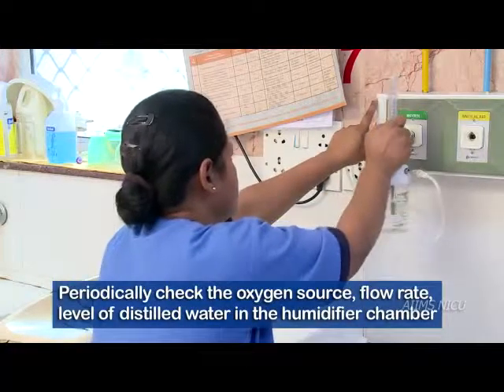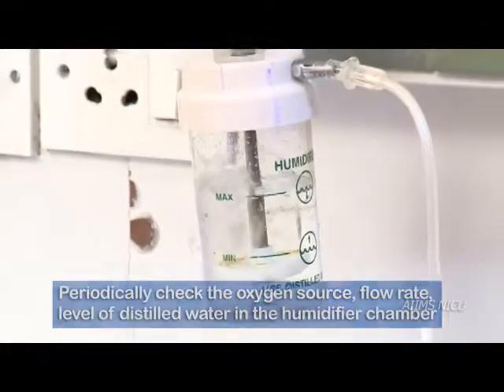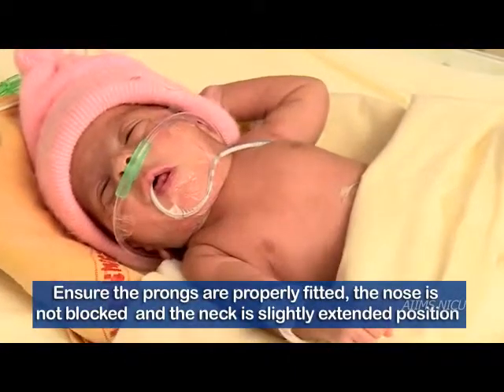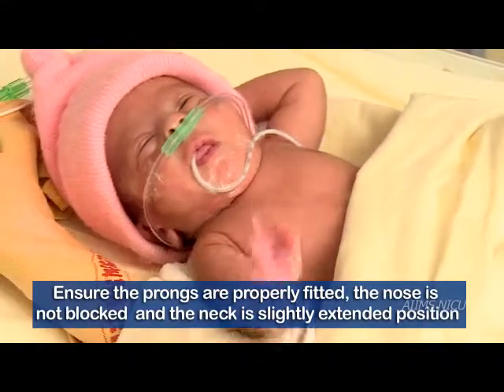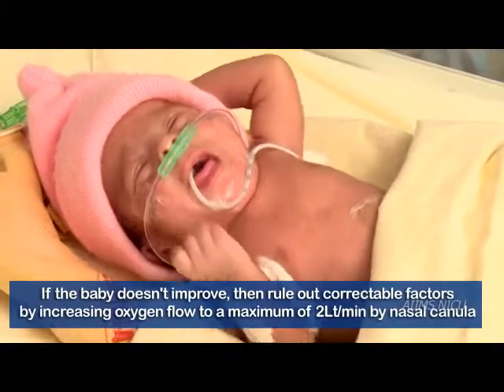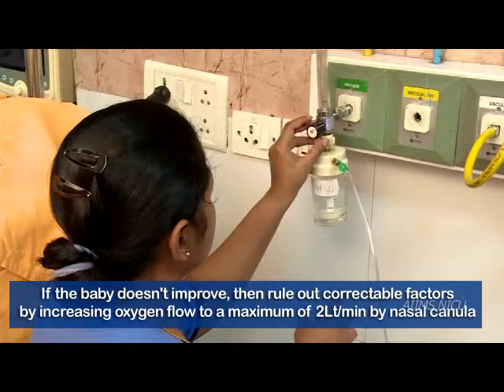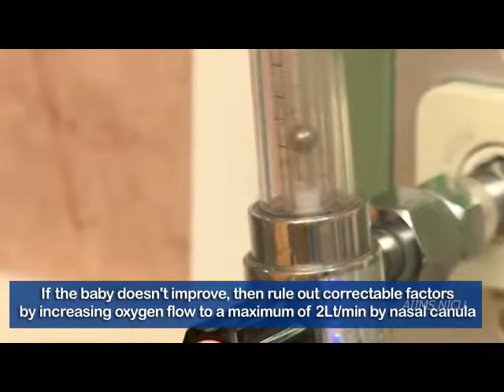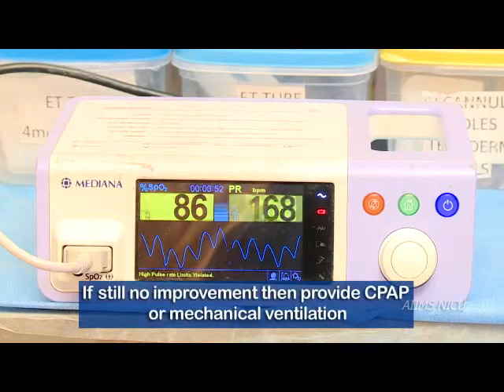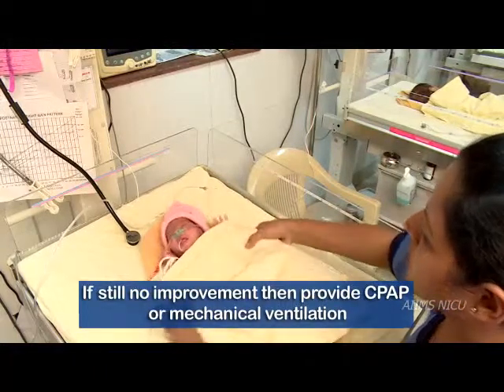Also, periodically check the oxygen source, flow rate, level of distilled water in the humidifier chamber, and always ensure that the prongs are properly fitted, the nose is not blocked, and the neck is in slightly extended position. If the newborn doesn't improve, then rule out correctable factors as mentioned and try increasing the oxygen flow to a maximum of 2 liters per minute via nasal cannula. If still there is no improvement, then provide CPAP or mechanical ventilation as indicated.